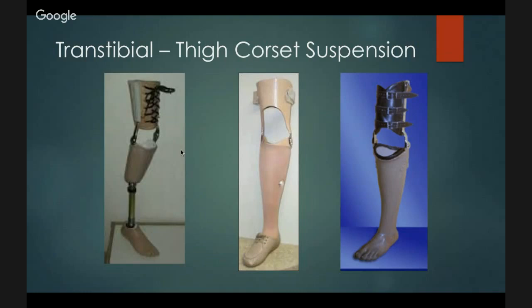Also, you see that this necessitates a joint, right? Or actually two joints. So you need those hinge knee joints. So it gives you a level of ML stability for somebody who's either lax or just has poor ML stability for any other reason. This can help stabilize that joint.